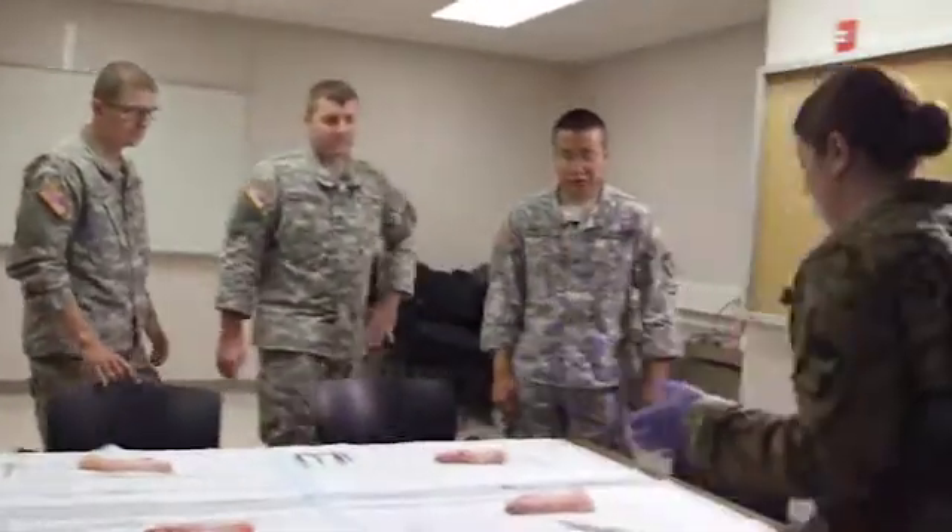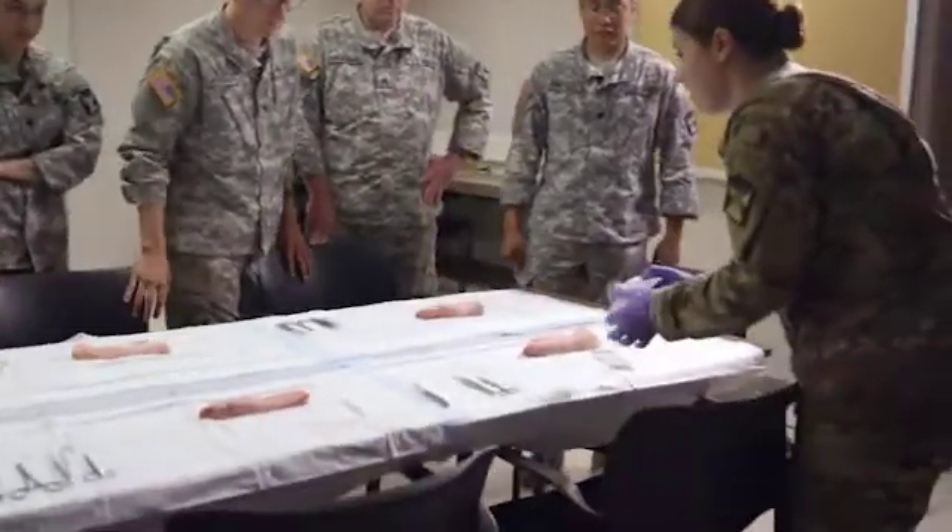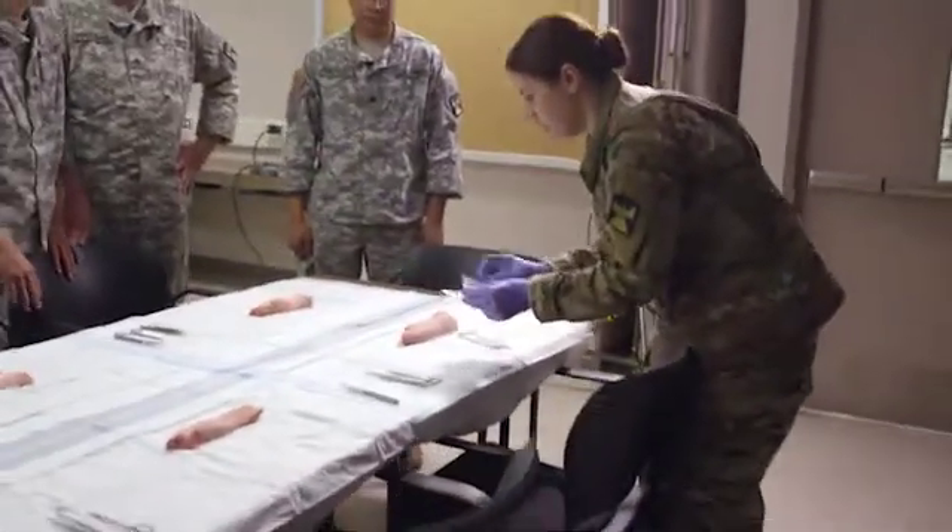Let's come on down here. Now that we've talked about wound care a little bit, let's give a quick demonstration, and then we'll break into stations here and you all can give it a try.